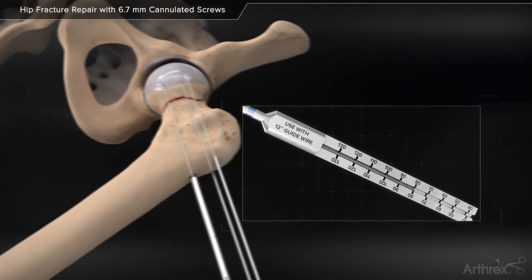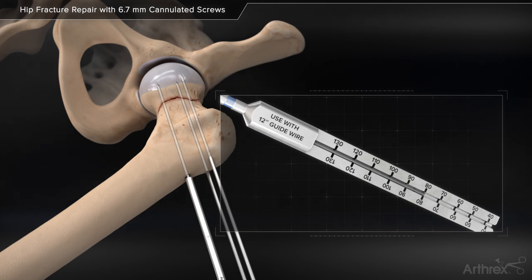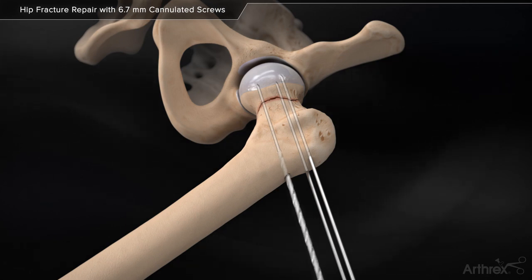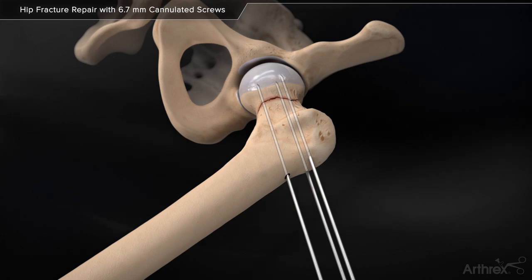The length of the screw is read directly off the depth gauge at the end of the guide wire. Pre-drilling and pre-tapping may be necessary in hard or sclerotic bone.